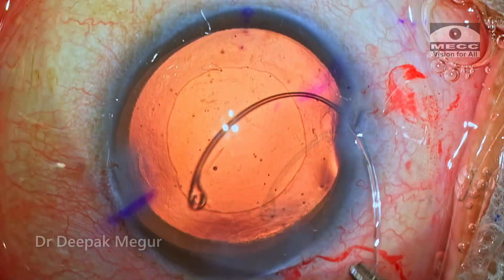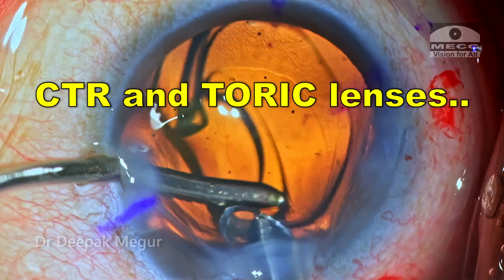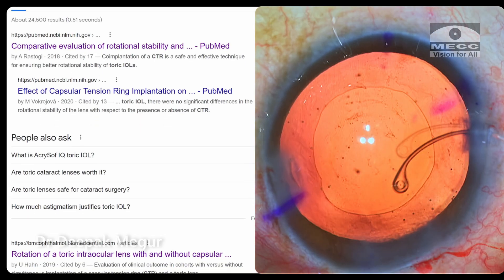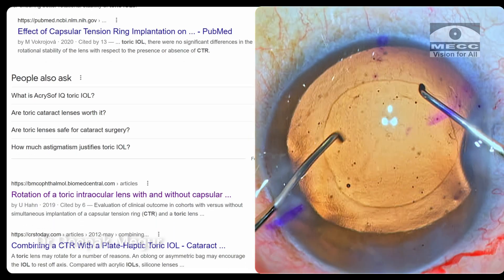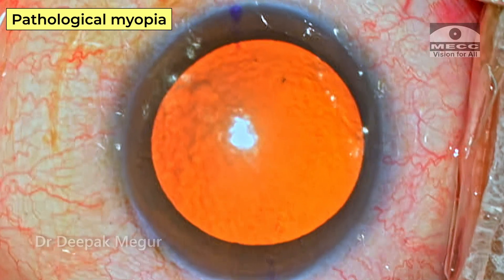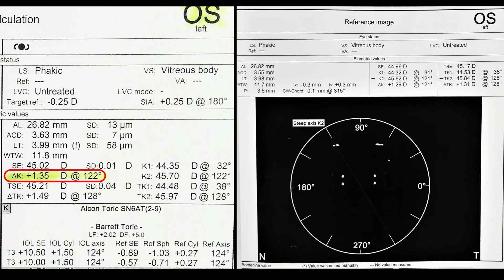Today we'll be discussing the use of capsule tension ring in eyes where we have planned toric lens implantations. Do they really help? Do they improve the outcomes? There's a lot of debate around this topic and let me share my experience with you. This is a 60-year-old lady who has nuclear cataract, she's having pathological myopia, and she's scheduled for a toric lens implantation as she has got a significant amount of pre-op astigmatism.